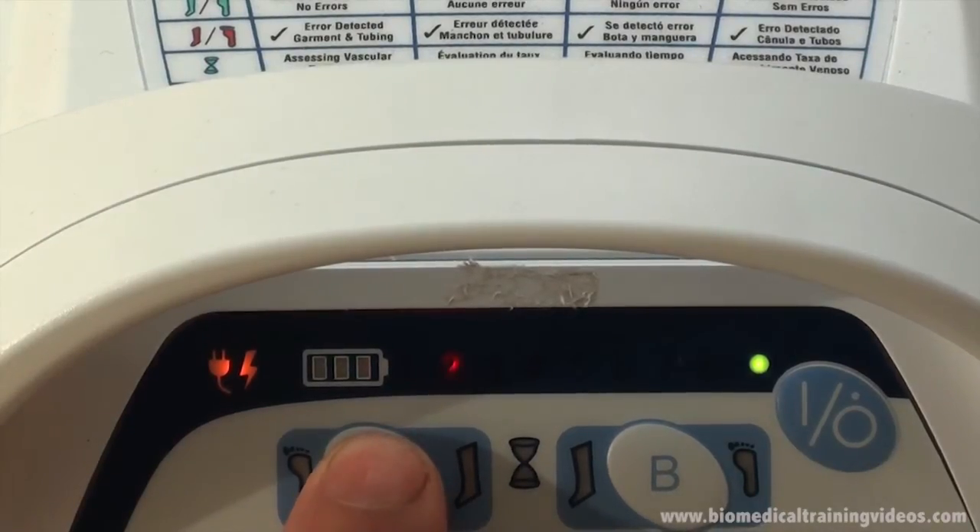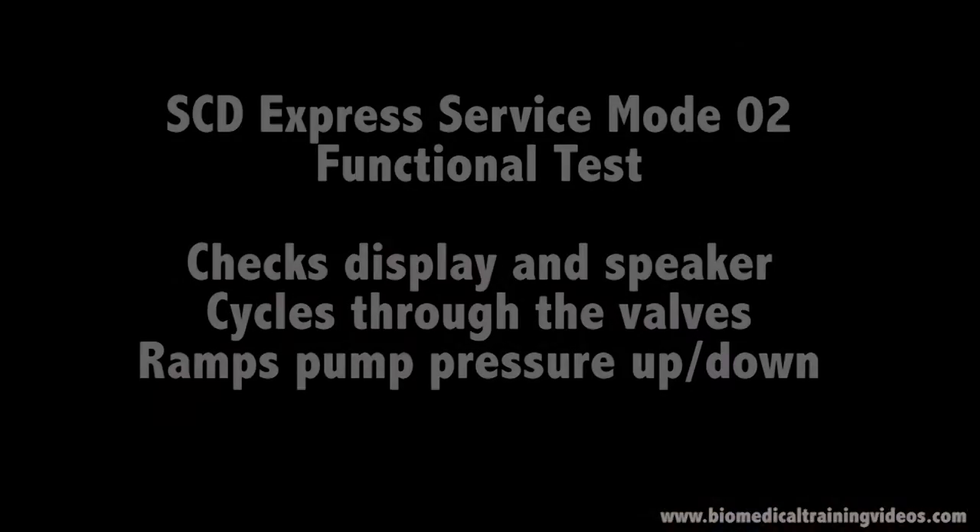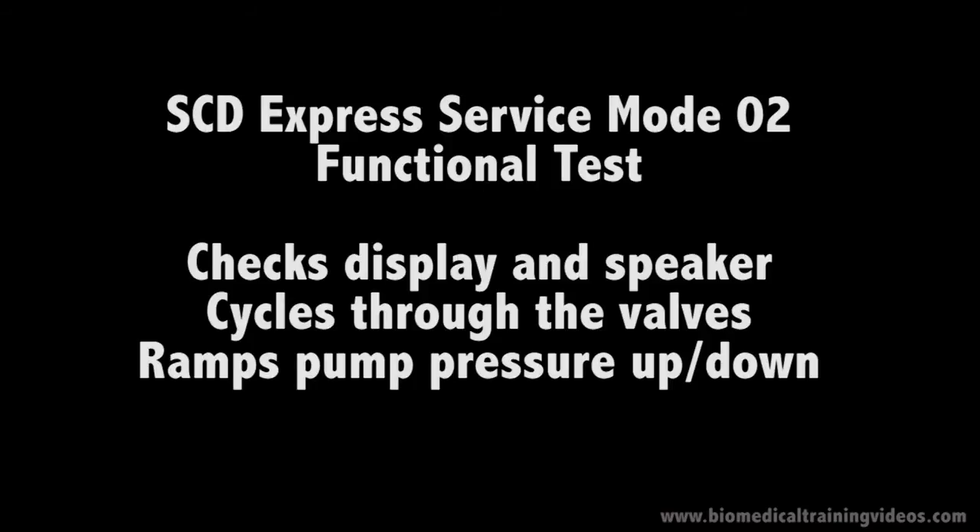Showing it advancing through tests 1, 2, 3, 4, 5, 6, 7, 8 and back to the start again. We will now cover service mode 02, the functional test.